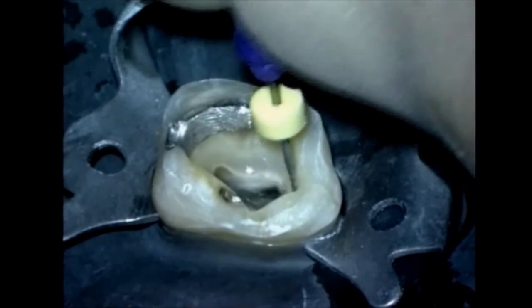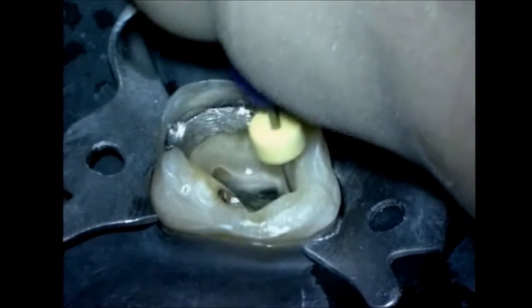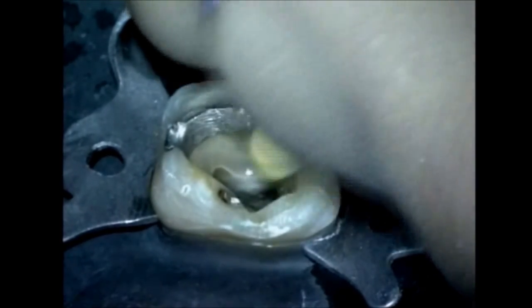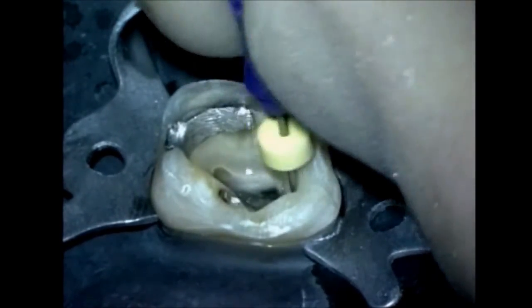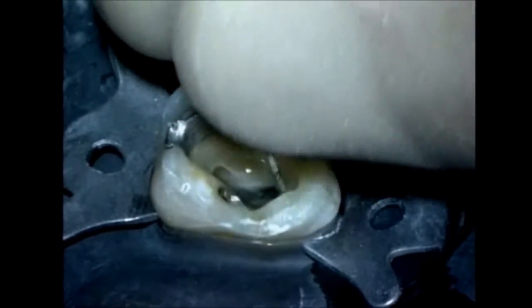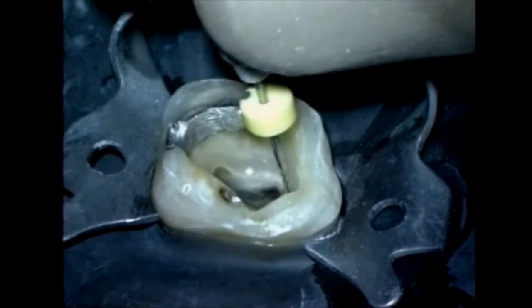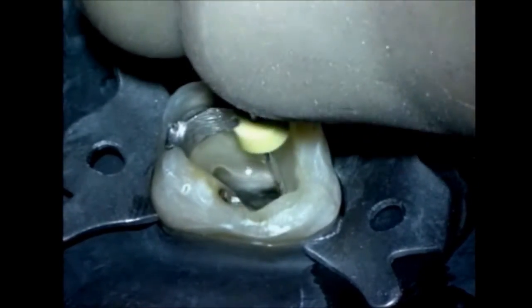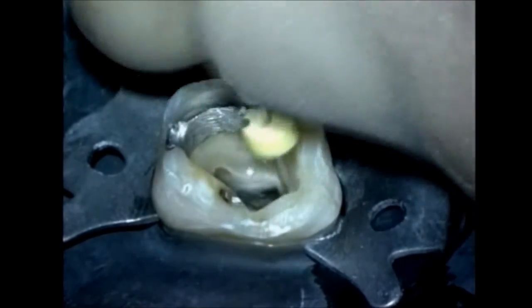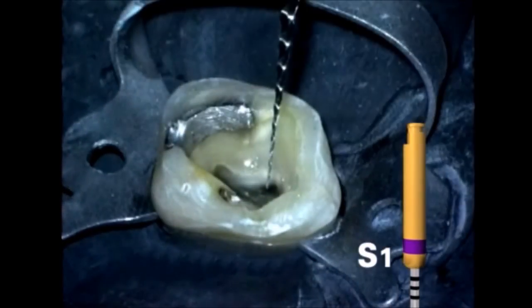Following complete access, a 10 hand file gives us information regarding cross-sectional diameter. We can observe the handle to see if it's on or off the long axis, and we can begin to determine if we have complex or straightforward anatomy. The 15 follows the 10. Another 5 to 6 cutting cycles refines the glide path, carries more irrigant deeper into the anatomy, and paves the way for rotary shaping files.